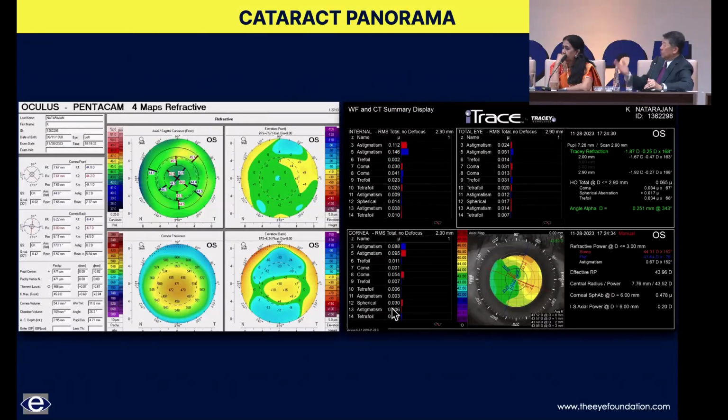I don't mind wearing glasses for the distance. Well, what does that mean? Does that mean minus 1.50, minus 3, minus 1.25? They don't even know, because they don't know that they might be really happy with minus 1 or a mini mono. So we'll often point out that with the light adjustable lens, we can maintain as much distance as possible, even if it's just in one eye, and yet still meet their critical need to be able to read as well as they want.